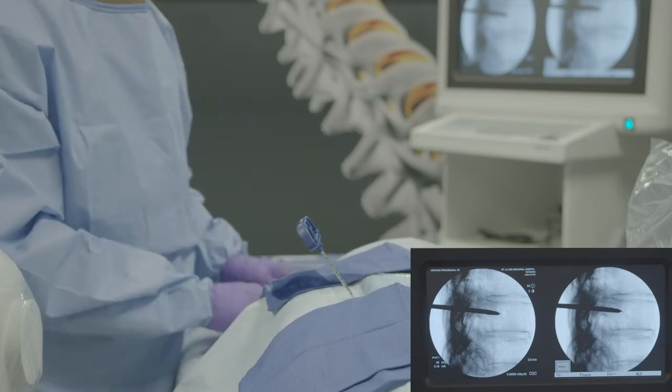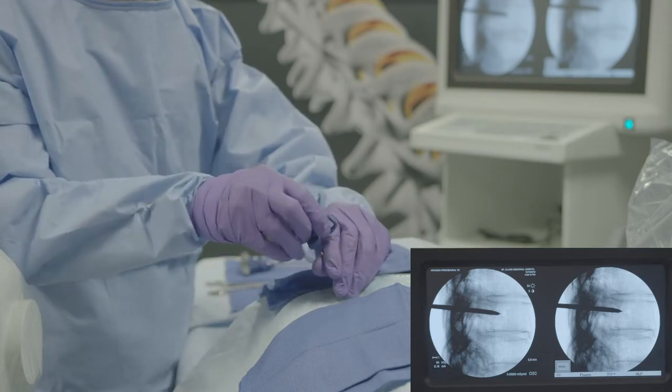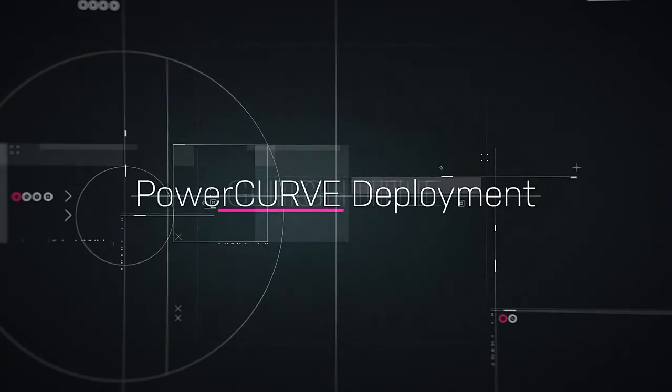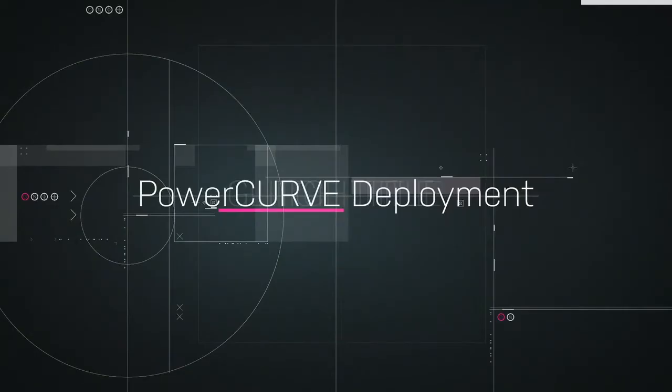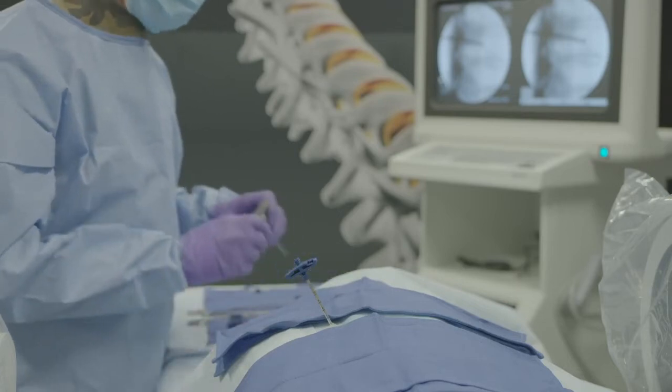While supporting the working cannula, rotate the access introducer handle counterclockwise and remove the inner stylet. Once the inner stylet is removed from the access cannula, the distal end of the access cannula should be a few millimeters posterior to mid-vertebral body.